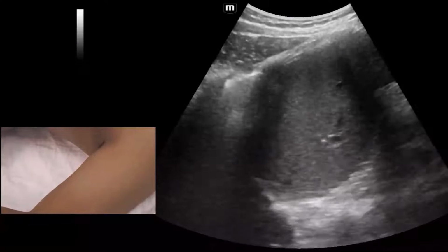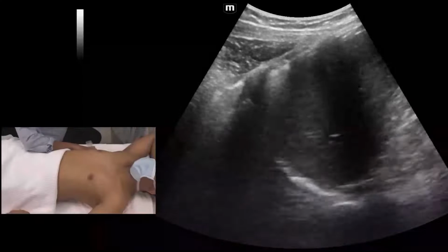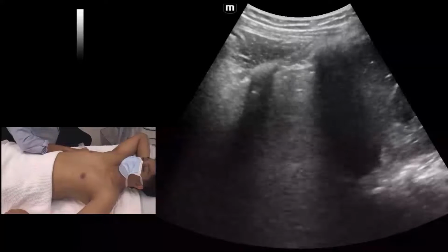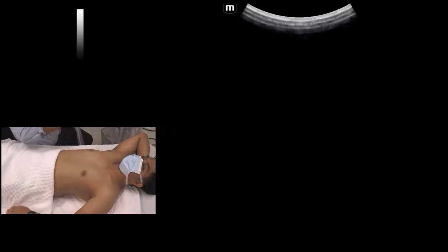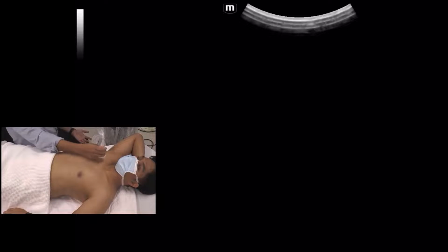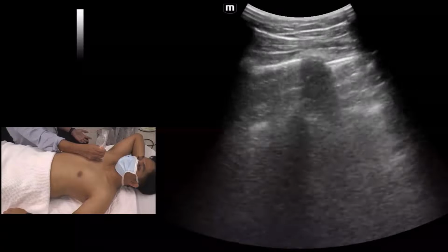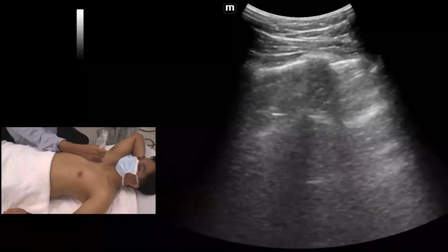If you are doing a screening in a patient who is in respiratory distress, the 4 points, anterior and posterior or posterolateral, will be the best screening lung ultrasound examination. Of course, if you want to be a bit more thorough, you need to go, as I mentioned, the topograph: 1, 2, 3, 4, 1, 2, 3, 4 again, and of course at the back. But in the case of a quick lung ultrasound examination, the 4 views, which are the views of the extended FAST, are quite good enough to reveal the pathology that we are dealing with.